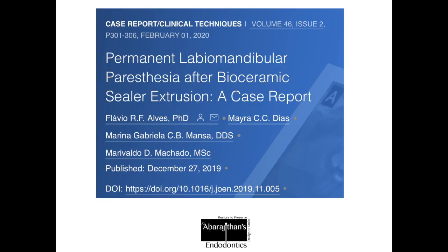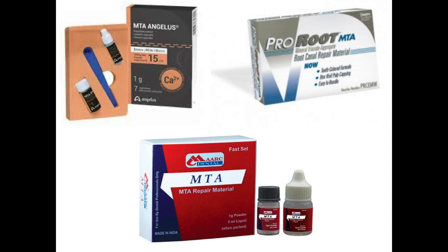Take-home message number one: many people think it is beneficial to push bioceramic sealer or calcium hydroxide into a lesion, but this is not recommended. In some cases you may get away with it as I did here, but if there is a nerve or critical anatomy apical to the extrusion site, it can cause serious problems — bioceramic sealers can also cause permanent paresthesia. From that point on, I never obturate or perform apexification with sealer alone, because it is very difficult to control sealer within the apex. The correct approach is to create a hard apical barrier of 4 to 6 mm.